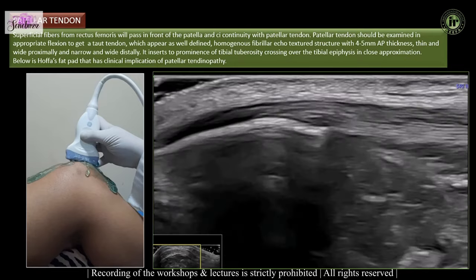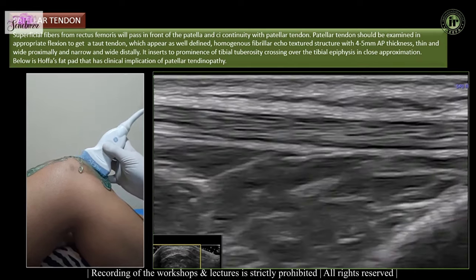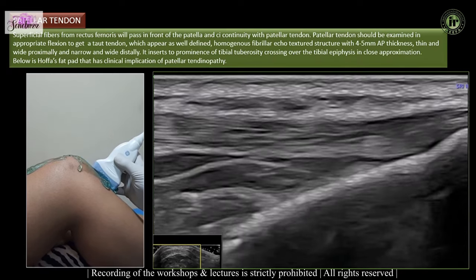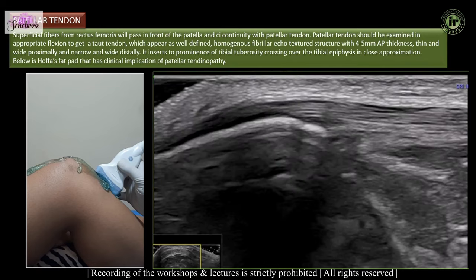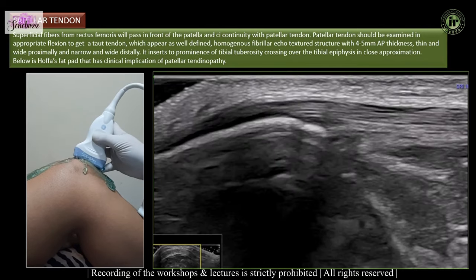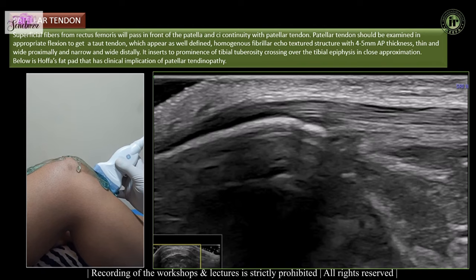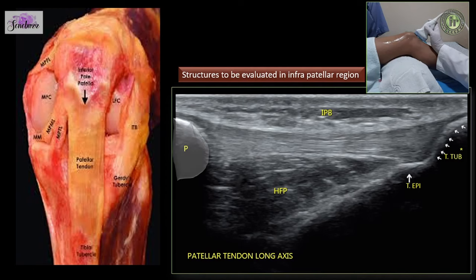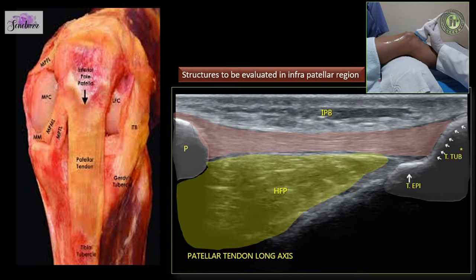Sliding the probe into the infrapatellar region, you can see the patellar tendon arising from the inferior pole of the patella, crossing over Hoffa's fat pad and the tibial epiphysis, and inserting into the tibial tuberosity. Joining the patella and the tibial tuberosity, we will see the nice fibrillar pattern of the patellar tendon, which is about 3 to 5 mm thick. It overlies Hoffa's fat pad, and this has clinical implications associated with patellar tendinopathy.